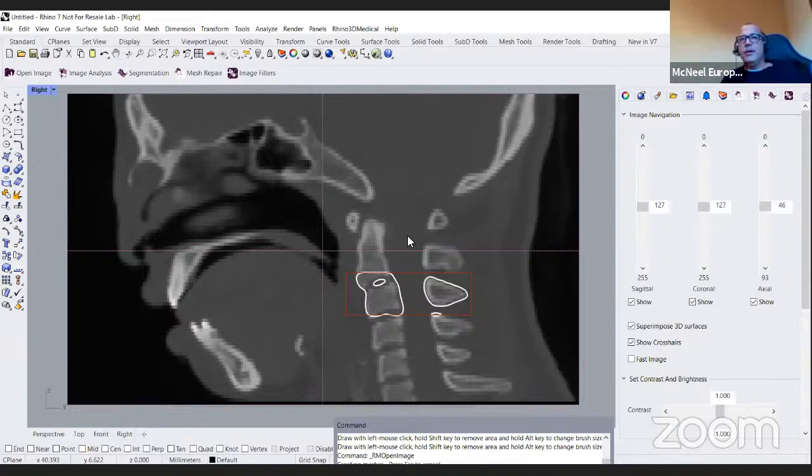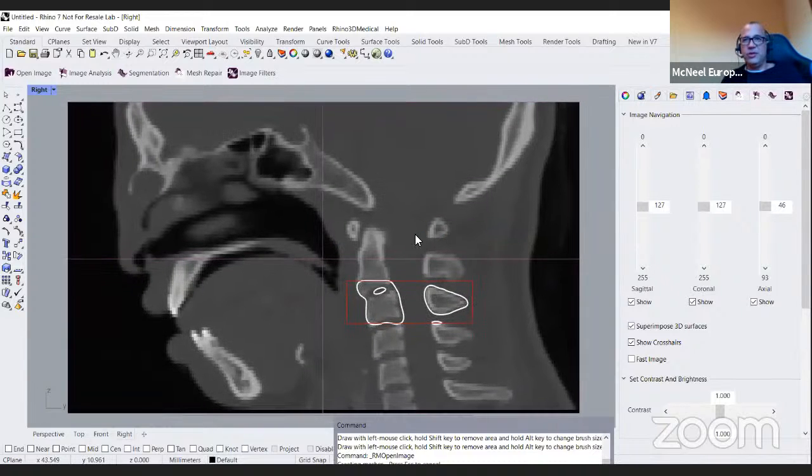Nice. Okay. In the middle of the questions, many people are again thanking you for your great presentation, like Harshit Gupta, Joe Boguski, etc. Sanerix asks if these functions are available only in Rhino3DMedical or also in Rhino3D. Well, it depends. Most of the functions Pablo showed are from Rhino3DMedical. Some others, like creating a bounding box, doing the Boolean difference, doing the measurement, etc., are Rhino inbuilt functions.